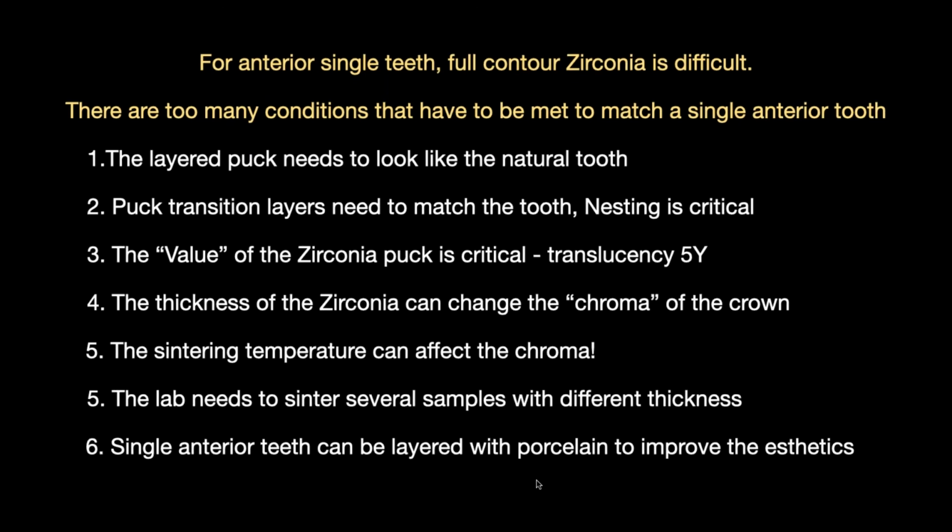The thickness of the zirconia, the chroma is going to change. So if you have something, it's like, how thin can I make this? If the thinner something is, you don't have enough thickness or material to carry the color. So you can see that when you have a molar pontic next to a bicuspid that's barely reduced because they don't want to take too much tooth structure off, and then you see a totally different look.